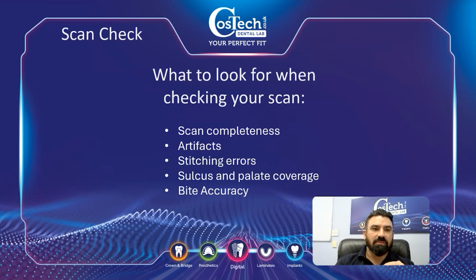Sulcus as well. Artifacts, we call them artifacts. This is where the tongue accidentally gets in the view, and the system has accidentally attached a bit of the tongue onto the palate or the teeth or something. Just be aware of it.